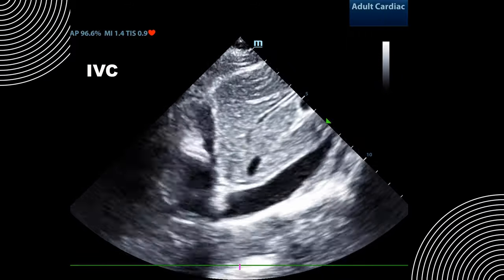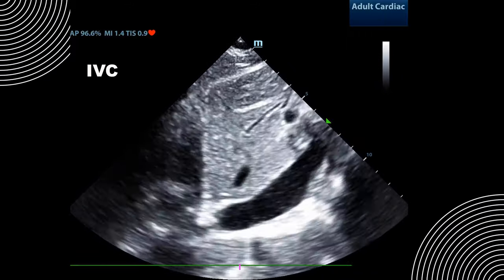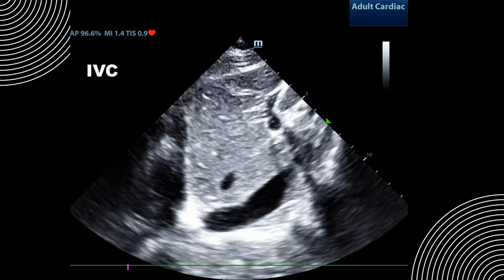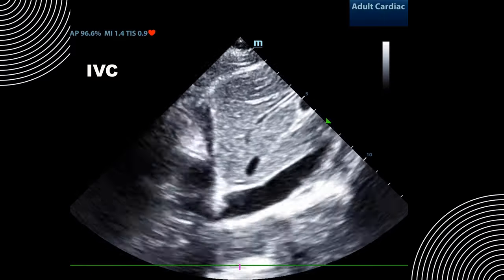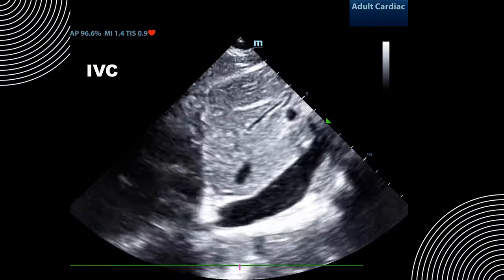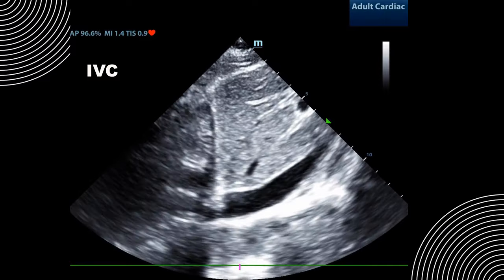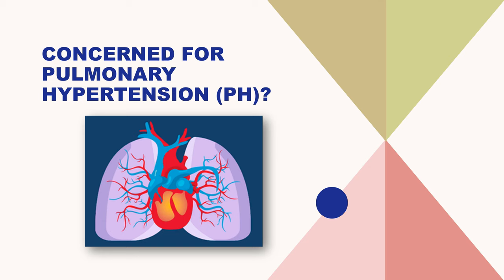To summarize, we have a hyperdynamic left ventricular ejection fraction, a large right ventricle with decreased function, a D sign, and a McConnell sign. This is concerning for pulmonary hypertension. If you're concerned for pulmonary hypertension, what advanced maneuvers can you do to measure pulmonary artery pressures?